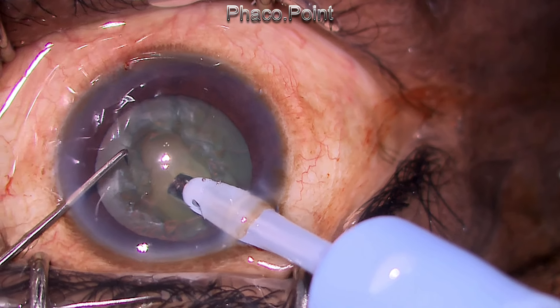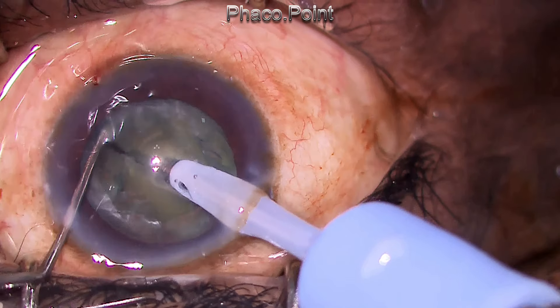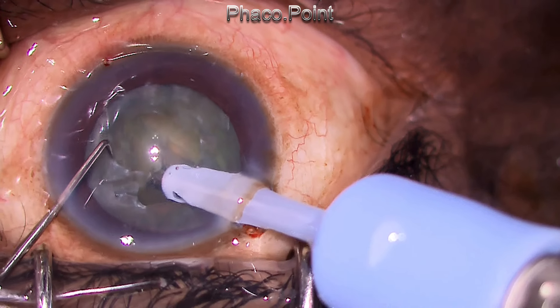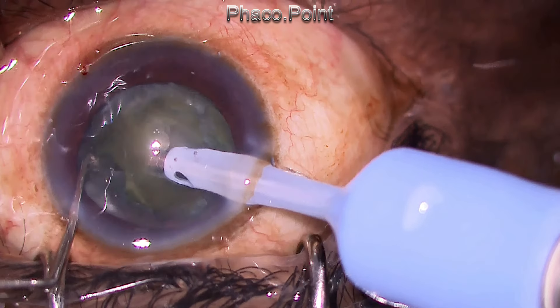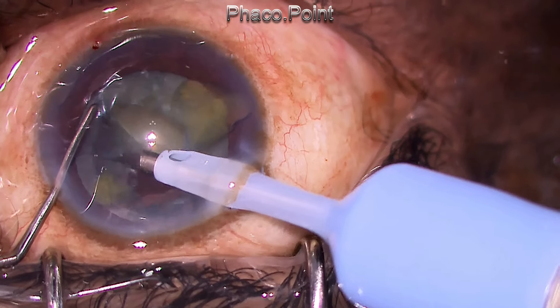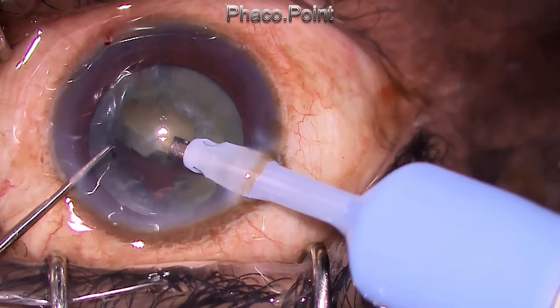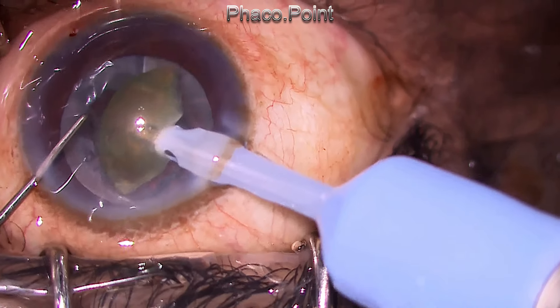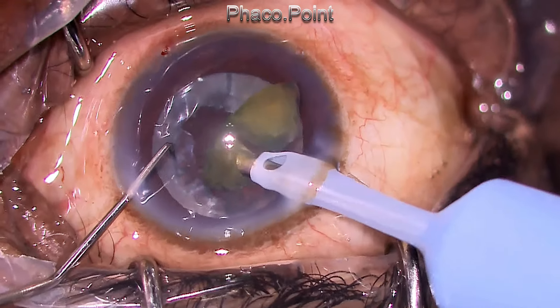As you create the phaco chop, this nucleus is not going to rotate. Then make two small cuts in the nucleus — this is about a grade 2 plus nucleosclerotic cataract. I found to my great surprise that the entire hemi-nucleus just pops out because I have done the hydrodelineation. If I had not done the hydrodelineation, I would have got stuck with a nucleus that neither rotates nor lifts up from within the epinucleus shell. The hydrodelineation has helped to remove almost the entire nucleus without any force to the capsular bag, periphery, or zonules.